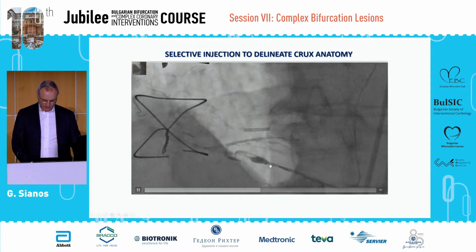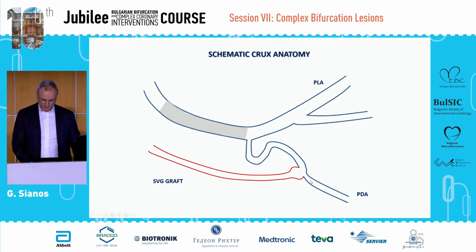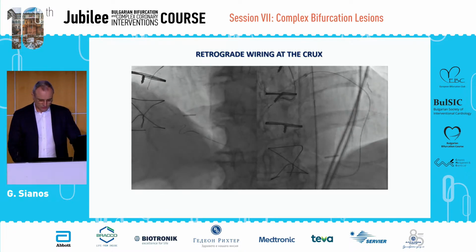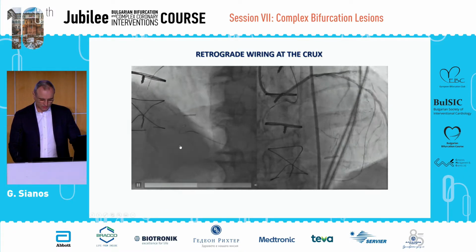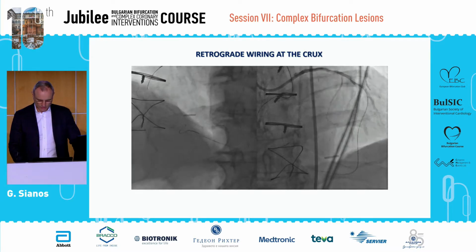That goes up, and then the vessel has been retracted by the distal anastomosis. So the anatomy is something like that, and you have in red here the vein graft that had a stent over there, and then you see the complexity and the tortuosity. And just at the end of this, there is a flush CTO here. And of course, you can understand the complexity of how you address, first of all, to reach the distal cap, which is already very complex, but then to work on that. So one short attempt here, it was obvious that this is not going to work, but just showing to you how much complexity you can reach.